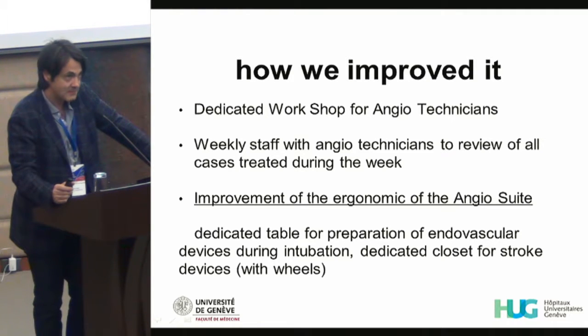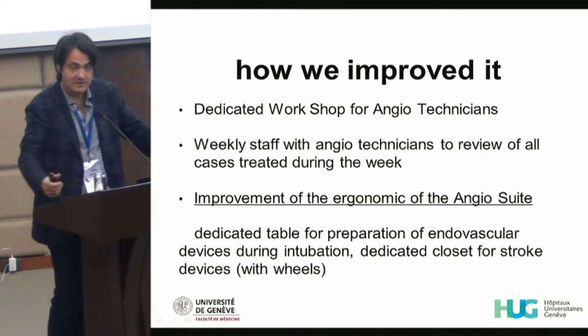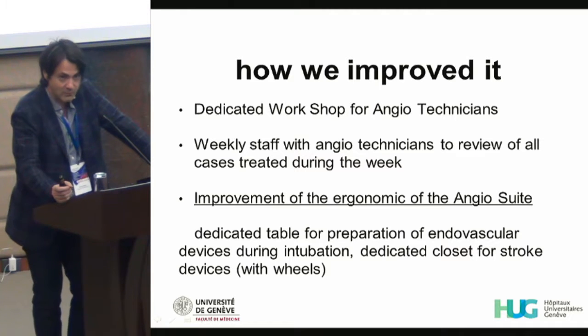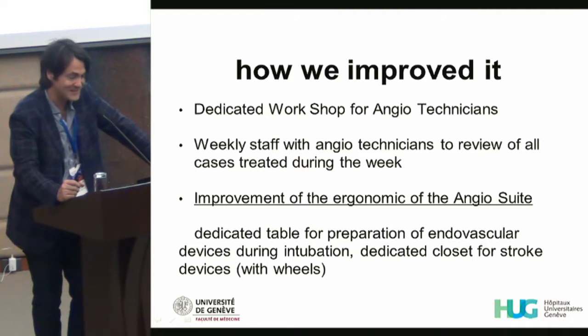Then we have made some modifications in the angio suite as well. In terms of ergonomics, we have tables with the measures of catheters. We prepare everything before the patient is intubated. We intubate all patients, as we'll see later on.